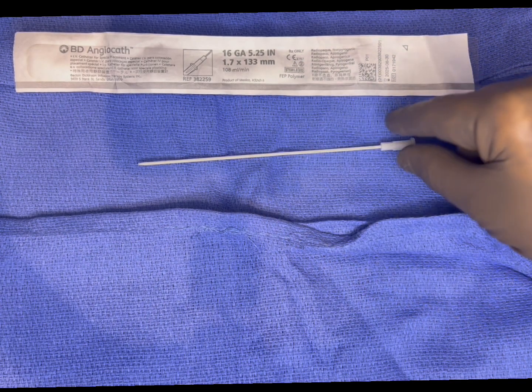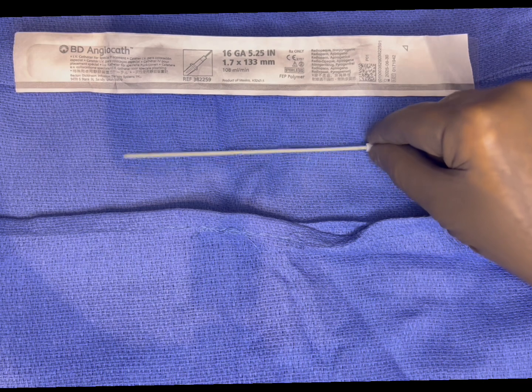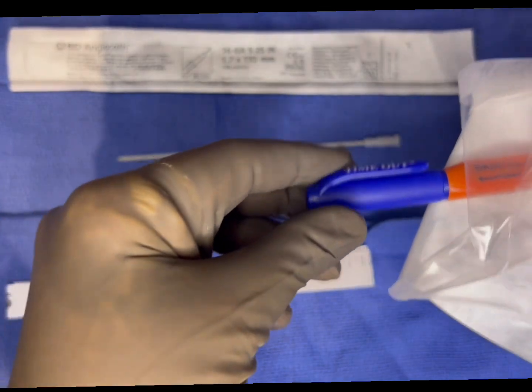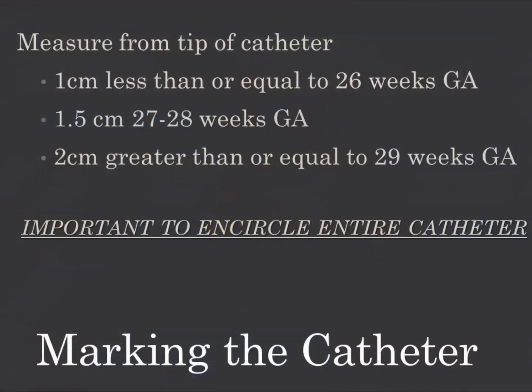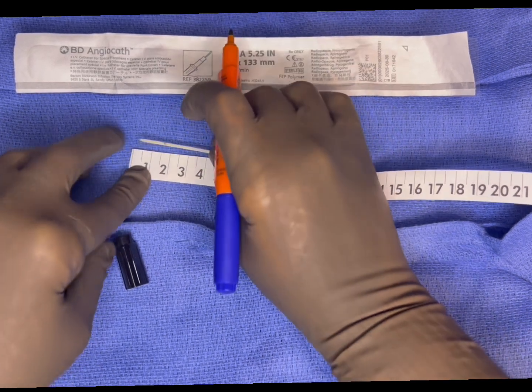After donning hat and mask, open a sterile towel. On the sterile towel, open the angiocatheter and remove the inner needle. Discard the needle in the sharps. Next, add the sterile measuring tape and the sterile marker. After donning sterile gloves, use the sterile tape measure to measure from the catheter tip: 1 cm for those less than or equal to 26 weeks gestational age, 1.5 cm for those 27 to 28 weeks gestational age, or 2 cm for those greater than or equal to 29 weeks gestational age. Once you've determined the measurement on the catheter, mark that on the catheter using the sterile marker.